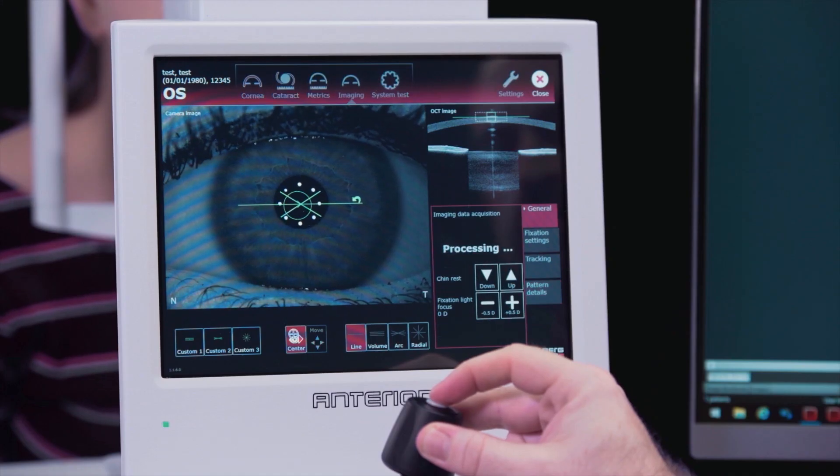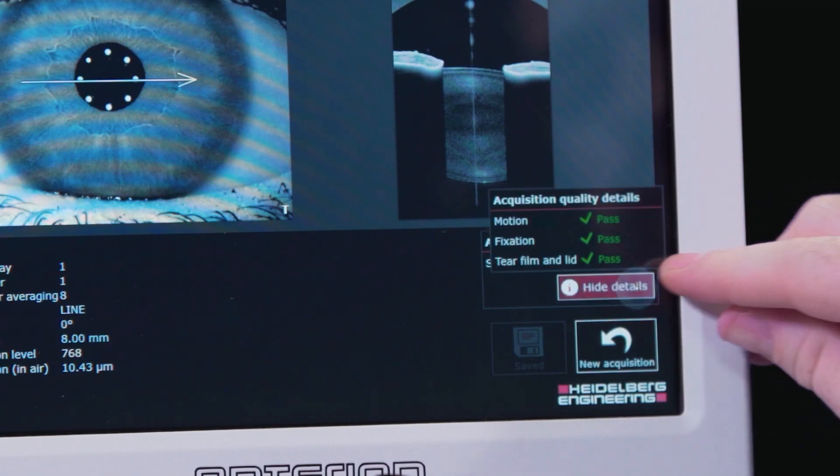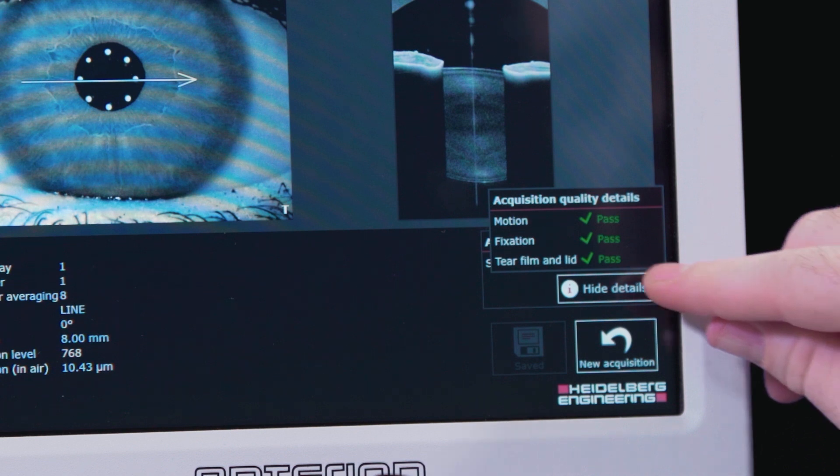The acquisition quality tab will display a pass, borderline, or fail on the image. A pass or borderline image is automatically saved. A failed result is not automatically saved.